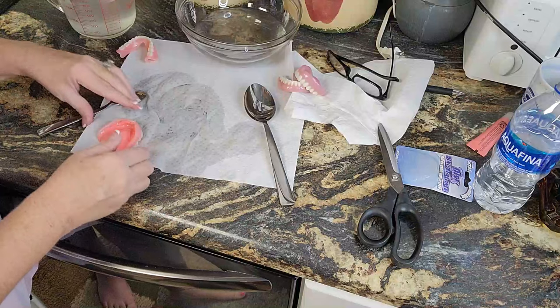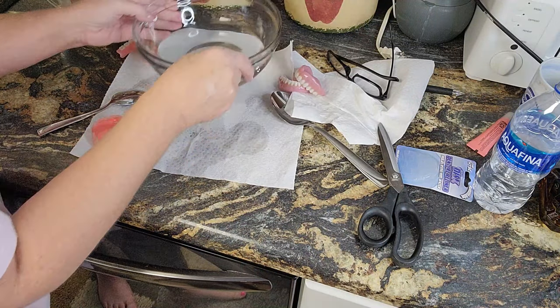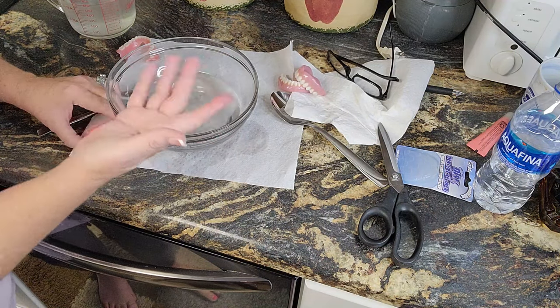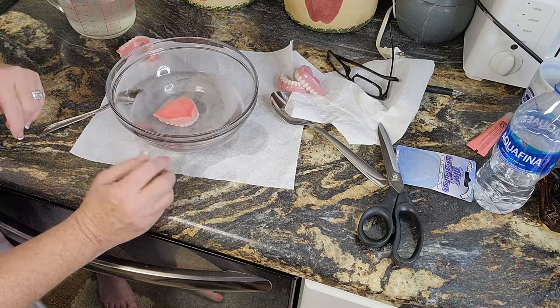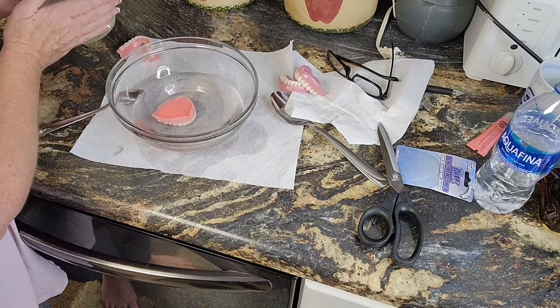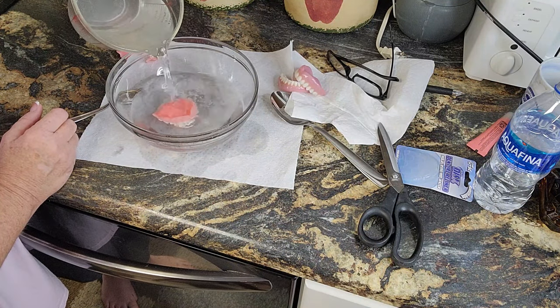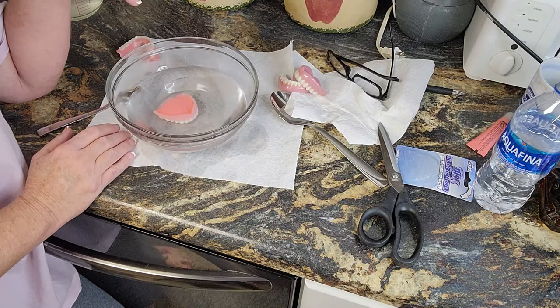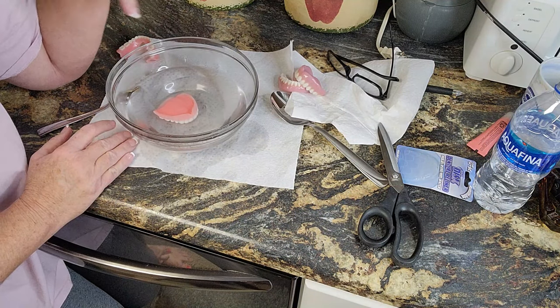But this is remoldable, so it says. Let's try that. Let's see if we can remold this. I'm going to put this back in hot water. All right, let me get the hot water back. There goes the dog. Okay, that's hot, warm to touch. I can touch it. Let's put the denture back in and see if we can get it out. I'm going to add some more of this hot water because it's still hot. I want to see how easy this is to come out and see if we can remold this and reapply it.